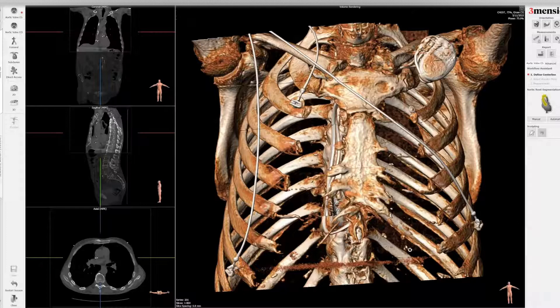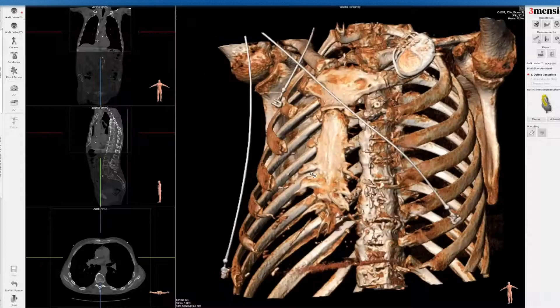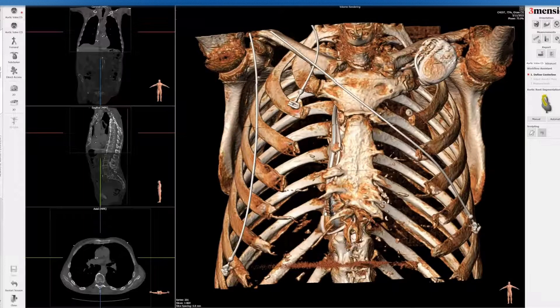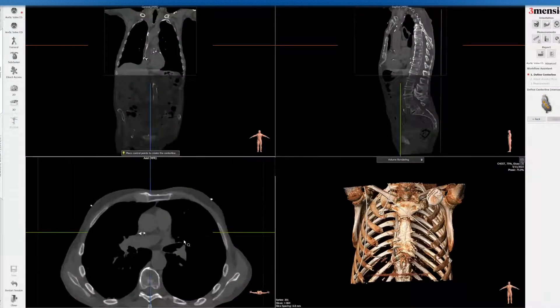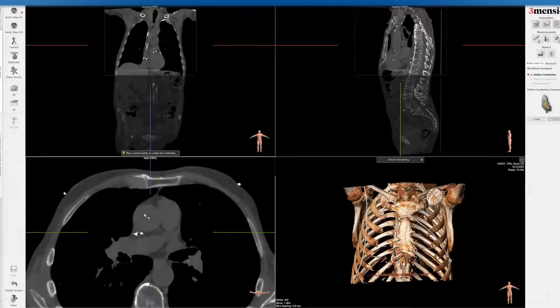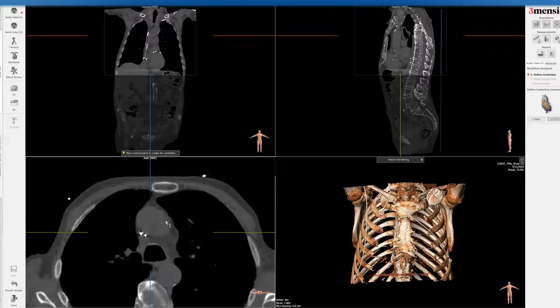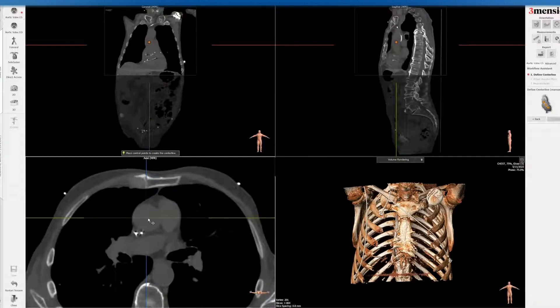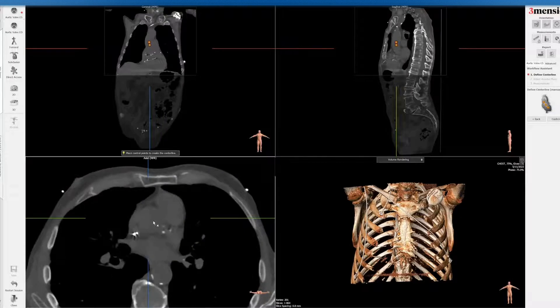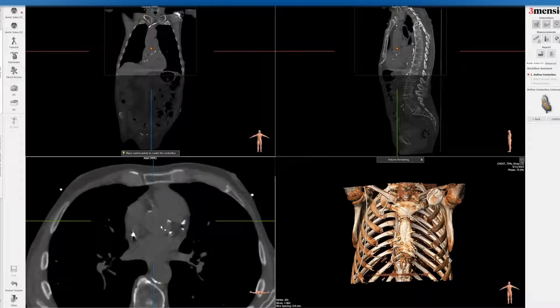You can see the interface here — this patient has no contrast, but you can still estimate the annulus and look at the aortic root anatomy. To start, you click on manual mode rather than automatic mode and go into this interface. The next step is to segment the aortic root manually. Start with the centerline from the ascending aorta — put a dot there and then go down towards the aortic annulus and the aortic valve.